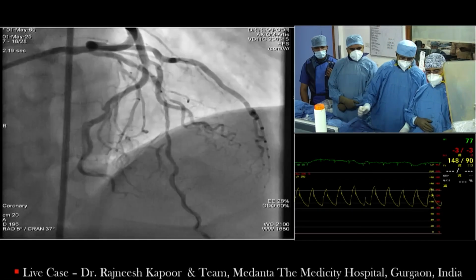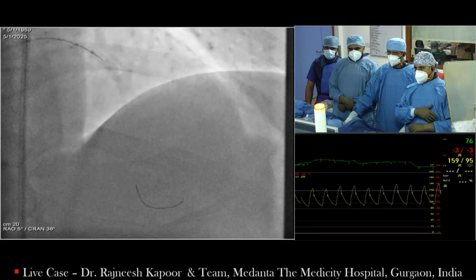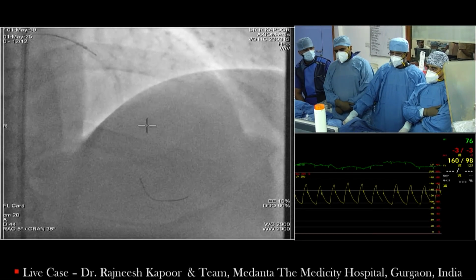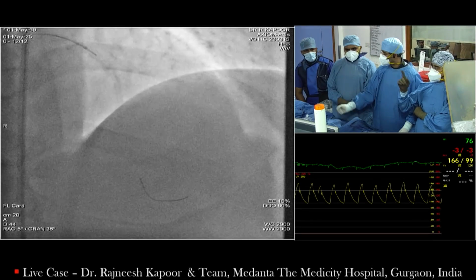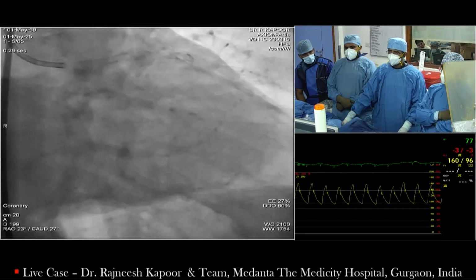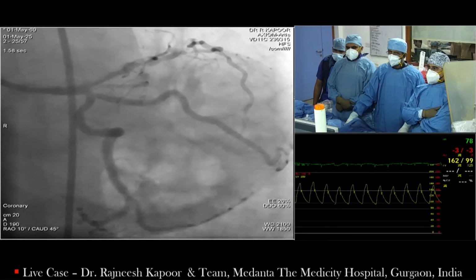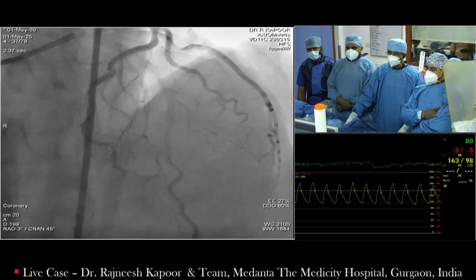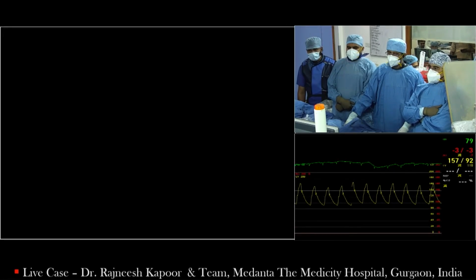I think it's a very important point. Like back home in Pakistan, also there are very few labs that have rota, and they end up trying this and then failing it. It's better to just stop there, send somewhere where there is an atherectomy device, or send for surgery instead of trying balloons. Absolutely. So I think that it's a good discussion with the panel that it's a very densely calcified LAD and we require some calcium modification. An atherectomy device is the choice, and so I'll tell you what we did.